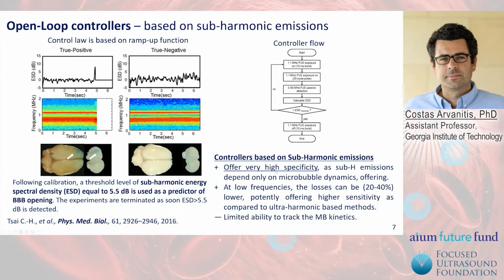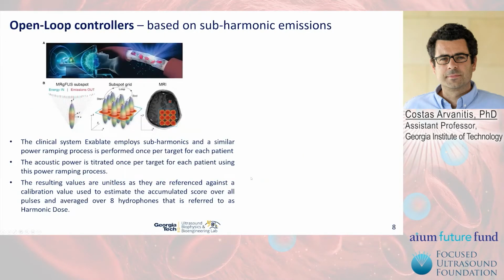So overall, this controller has very high specificity, again, as the subharmonic emissions depend only on microbubble dynamics. It can be slightly more sensitive than the ultraharmonic method, as it uses lower frequencies, but it also has limited ability to track the microbubble kinetics, which can be important.